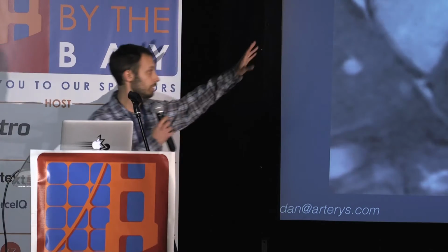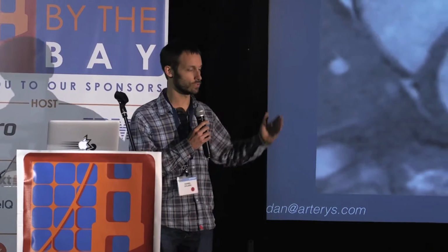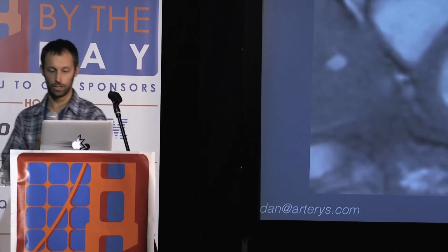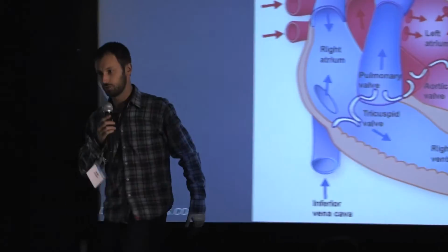Right over here, I should say a typical SSFP acquisition consists of slices along the short axis of the ventricle. So if you remember from the previous slide, maybe I'll jump back for just a second. The heart has a long direction and a short direction. So these slices, come back one more time, are cuts like that through the ventricles.